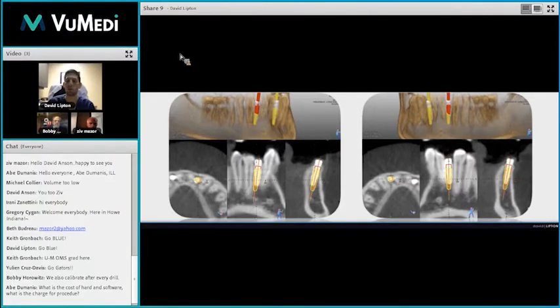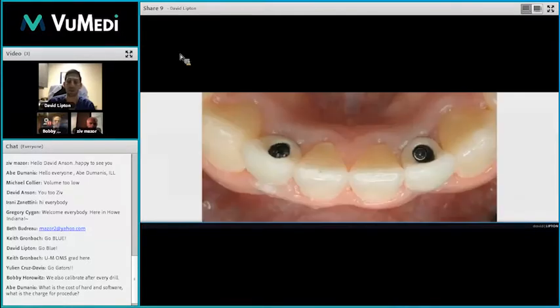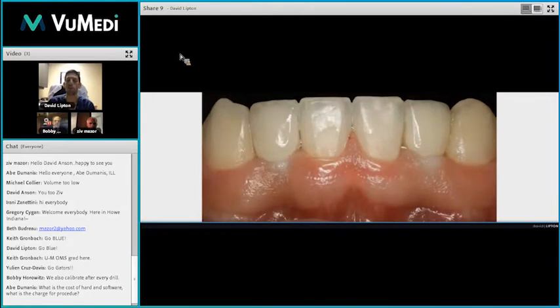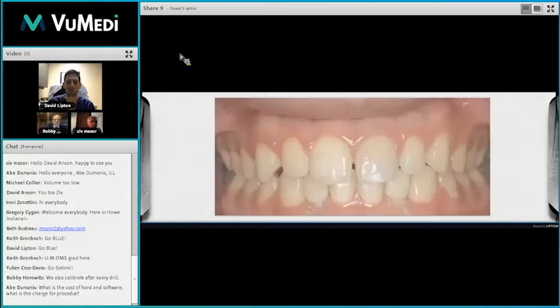So we continued through the digital workflow, and these images are courtesy of our restorative doc. And looking at the final result, we got it screw retained in the right place. Aesthetically, could have probably used some gingivectomies, but overall, this is a 22-year-old now without a transitional partial denture, has a fixed appliance in his mouth, and he can go through the rest of his senior year of college enjoying life. So overall, it's a beautiful result using dynamic navigational surgery.